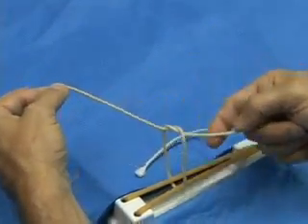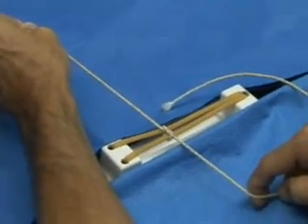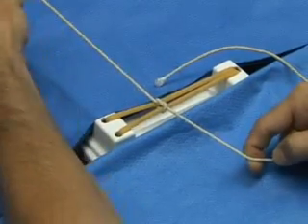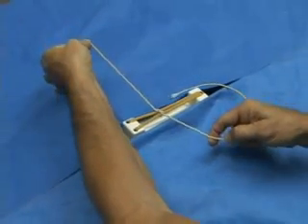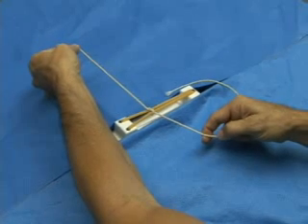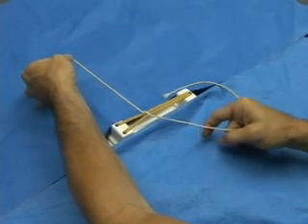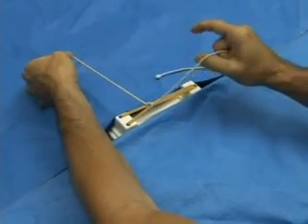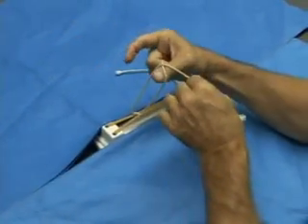Now we've got our first half hitch, and we'll take that down to the knot tying board. Now we want to create another loop, but at the end of this throw, we want the strands to end up in opposite directions. So we have to create the loop a little bit differently — this time we're going to use the thumb to catch this strand coming up. Create our loop here.